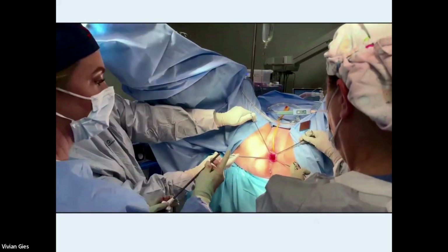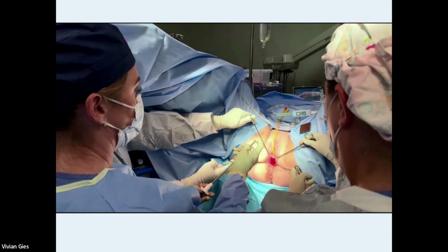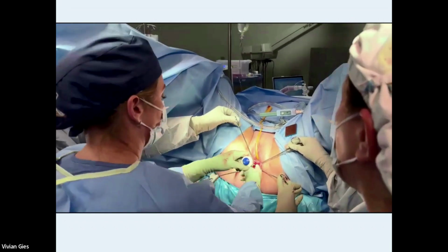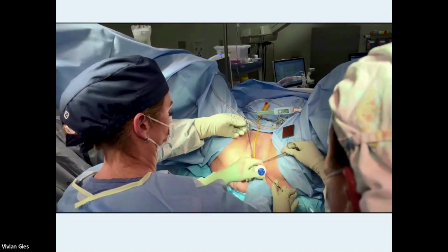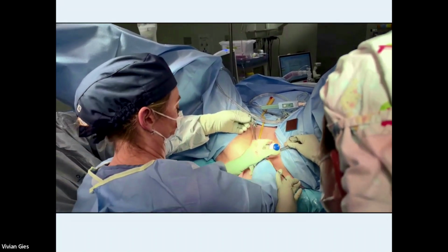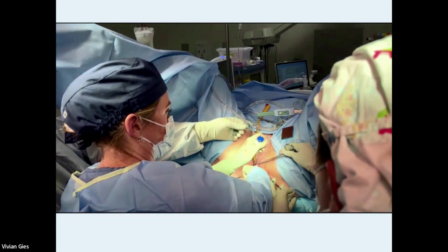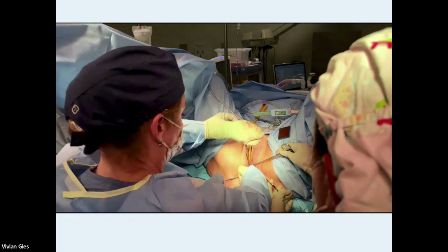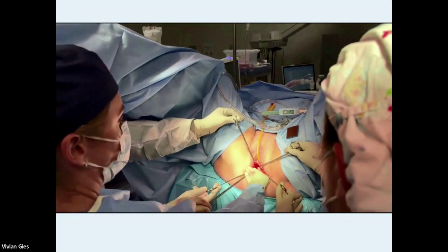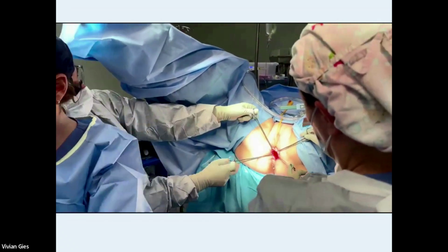There you go. So my dissection's already completed in the anterior compartment of this patient. That's me. I always check my tip and I always push it back in myself. I always load them myself. I trust no one. So I always start on the patient's right side. And your fingers really have to be your eyeballs. You have to know your anatomy. Deployed, pull out. I either hand them off or I'll tie this or clasp the sutures to the drape.